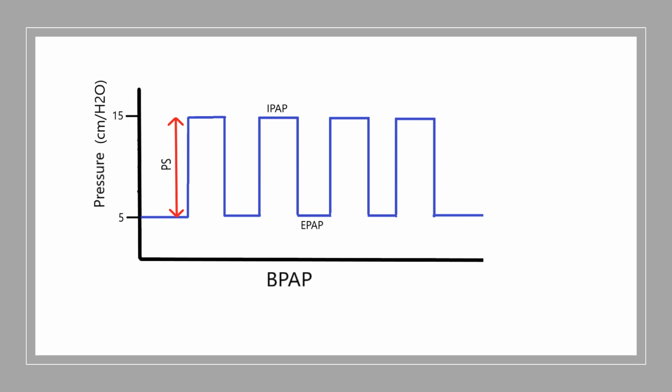So you still have CPAP, which in this case is what the EPAP represents. That's just the exhalation pressure. That's that constant pressure that's being provided. And then there's a second pressure with this strategy. It senses the patient take a breath in, and then it increases the pressure during inhalation, which provides an assist and removes work of breathing.